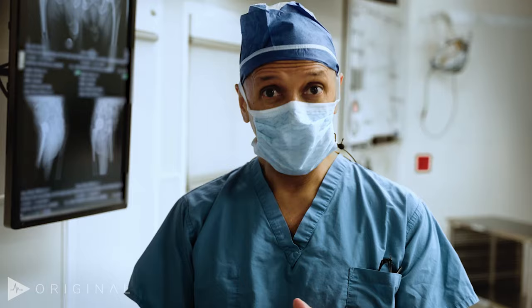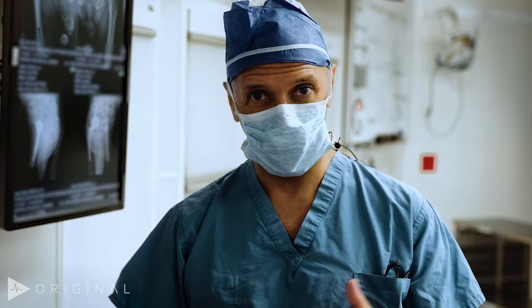Minimizing the likelihood of dislocation is the fundamental and most important aspect of doing an operation that has longevity and full function.